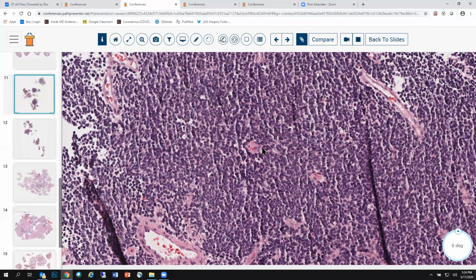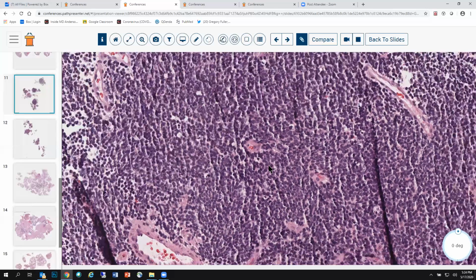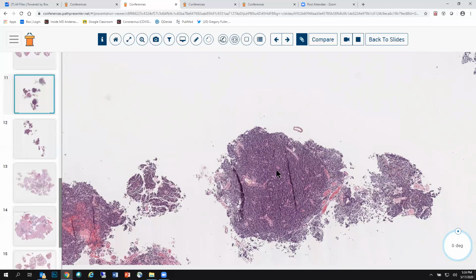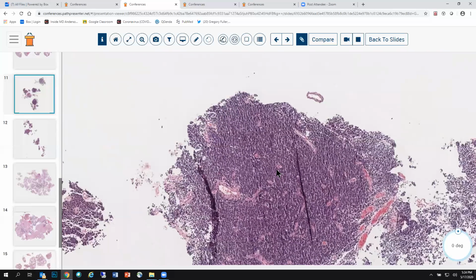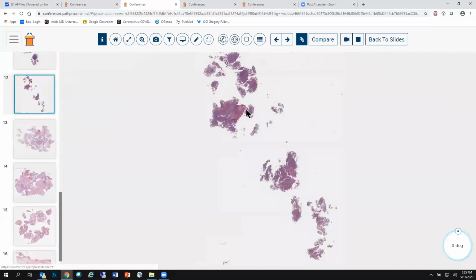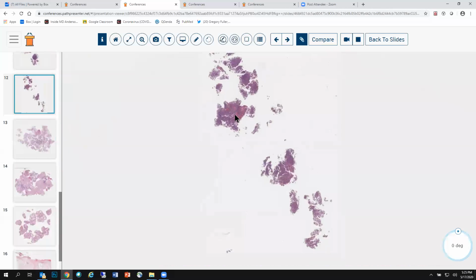Every neuro-oncologist wants to know the molecular signature, and we can use immunohistochemistry to do that, which was reviewed in part 1. So bottom line, small round blue cell tumor. This particular example was from the cerebellum: medulloblastoma until proven otherwise. But you must run INI-1 to rule out atypical teratoid rhabdoid tumor. It's a good idea to do that on every tumor that you suspect to be medulloblastoma in the cerebellum. That's a good lesson.